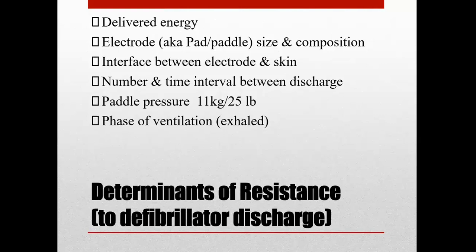And then the phase of the patient's ventilation. Full exhalation is best. The patient's not breathing, so when we stop providing ventilation, they will be in exhalation. And then obviously just familiarity with and knowledge of the operation of the equipment to perform defibrillation is super important.